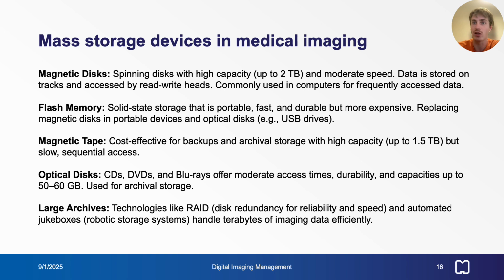Magnetic tape remains a cost-effective option for backups and archives, while optical discs, like DVDs and Blu-ray, provide durable storage for moderate amounts of data. Advanced technologies like RAID and automated jukeboxes handle the immense storage needs of modern medical imaging facilities, ensuring reliability and accessibility.